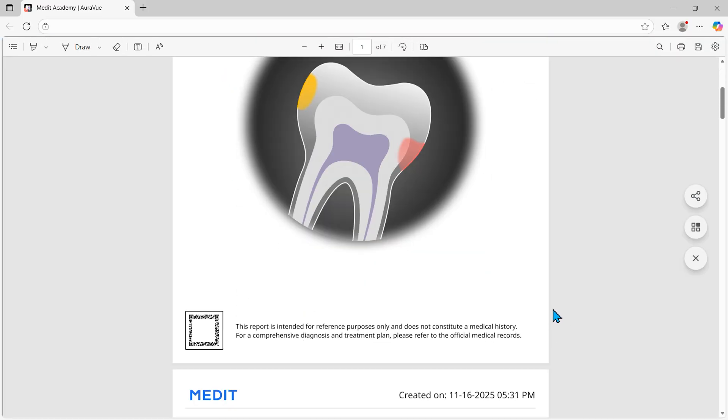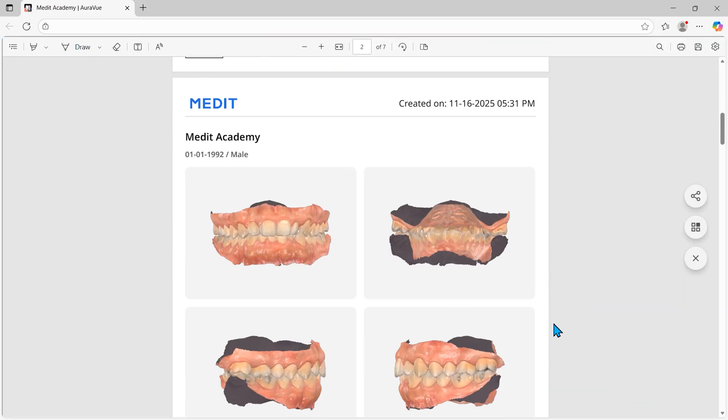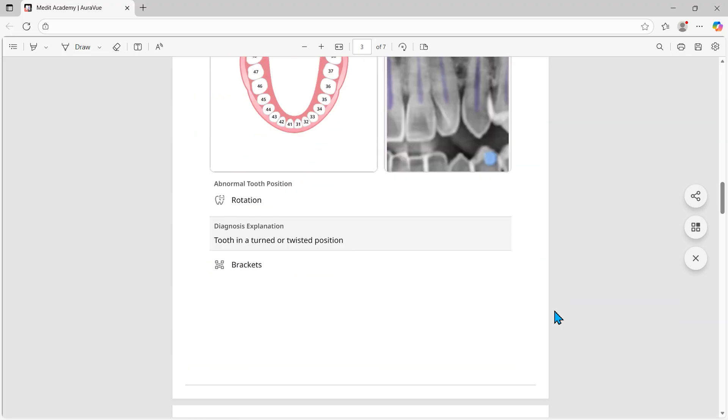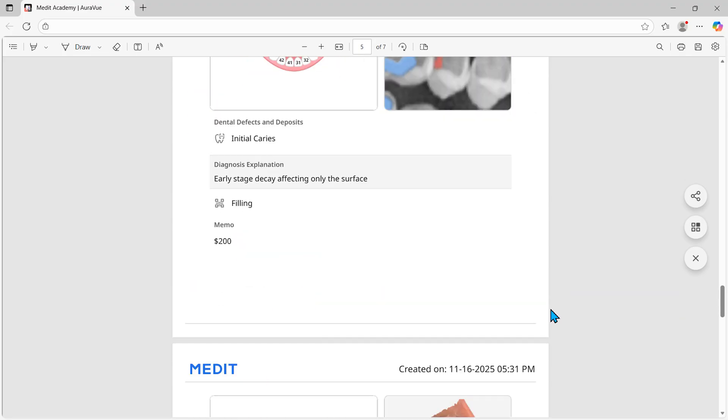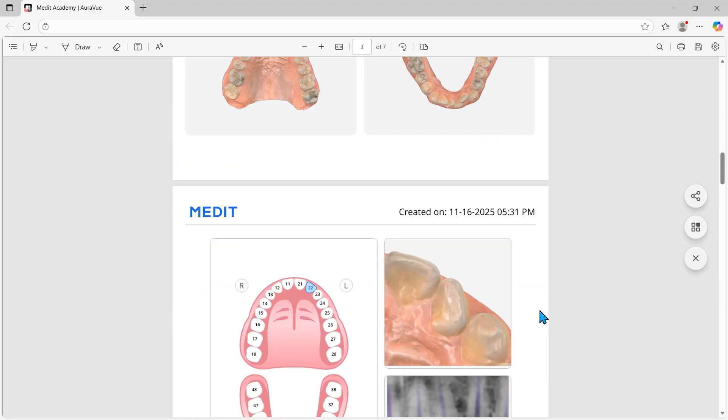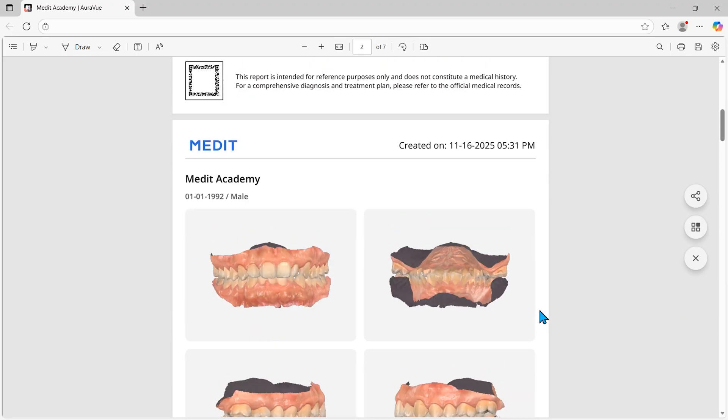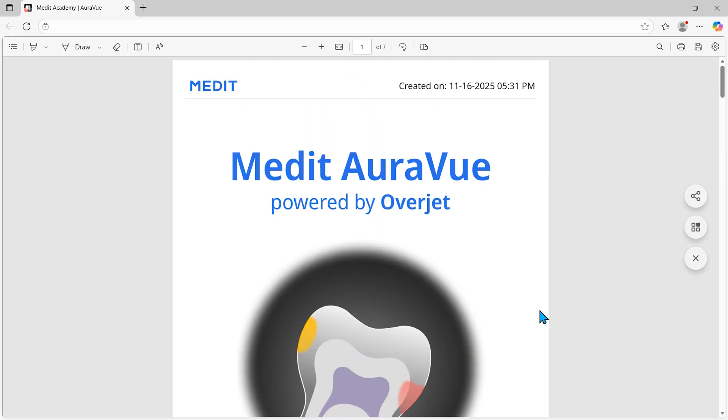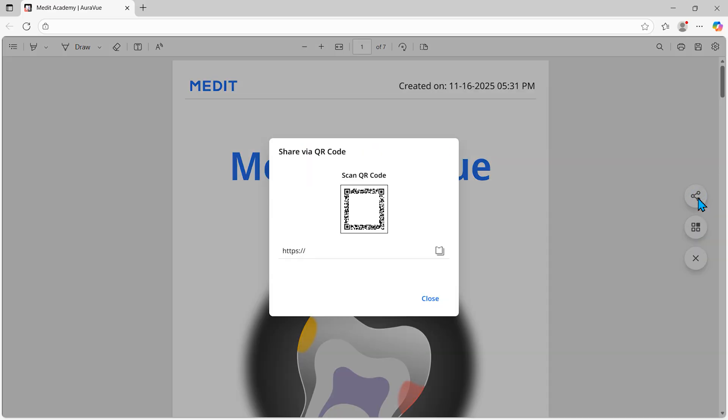Now, you have a professional patient consultation report based on scan data and radiograph images. It can easily be shared with the patient via a QR code.